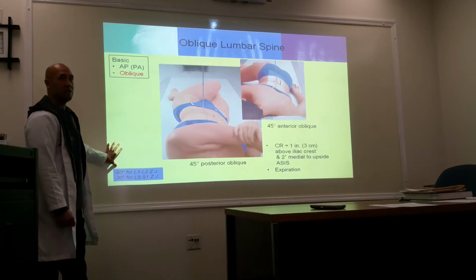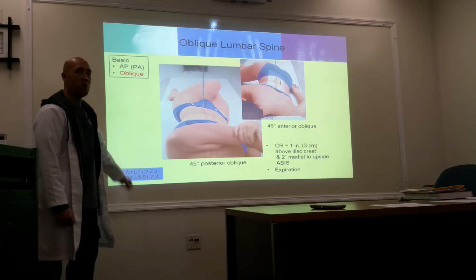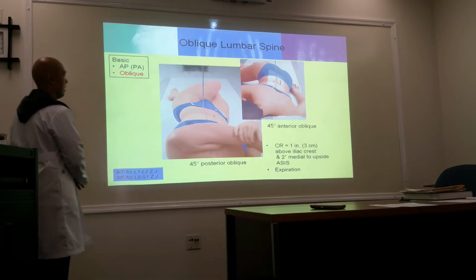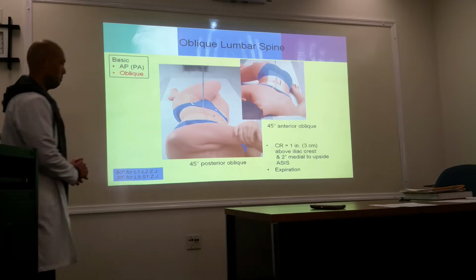You guys need me to repeat that? Yes. Okay. 50 degrees for L1, L2. 30 degrees for L5, S1.